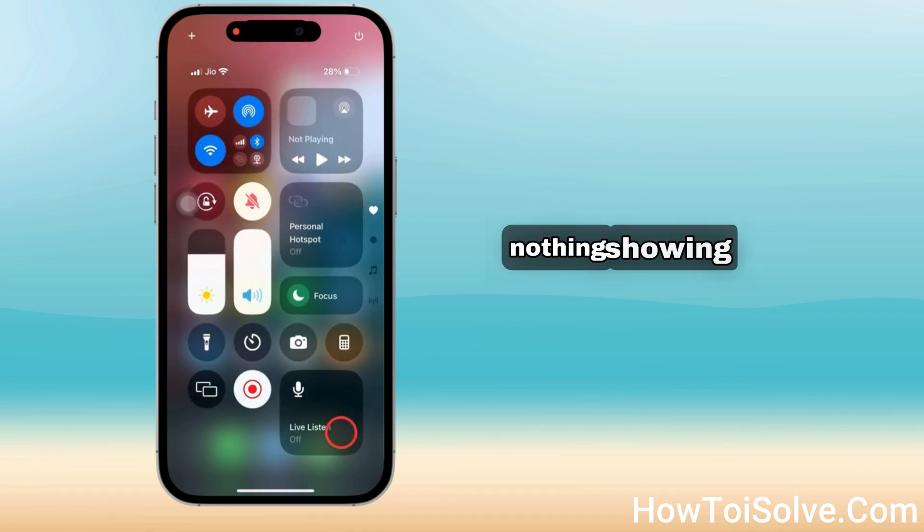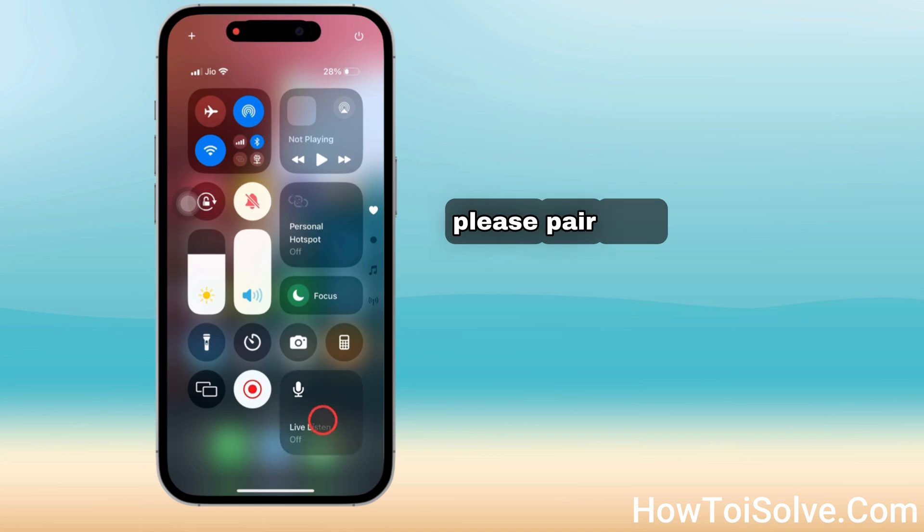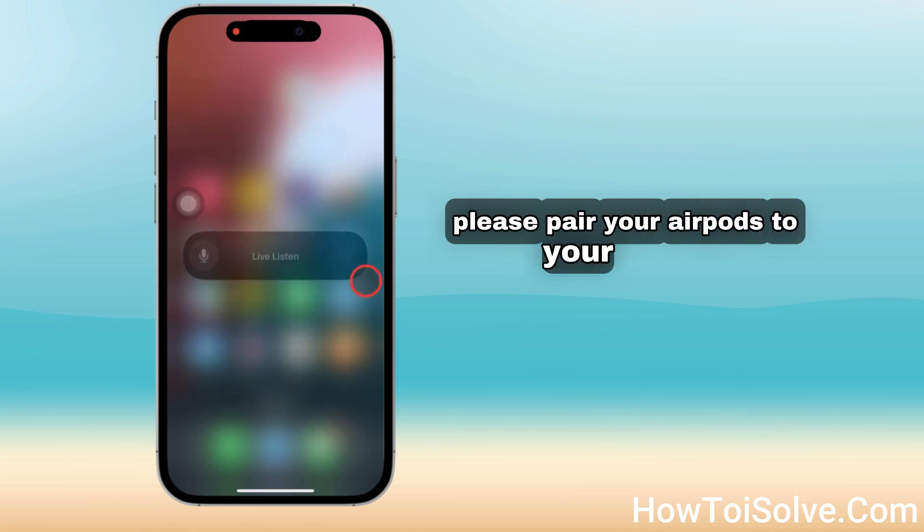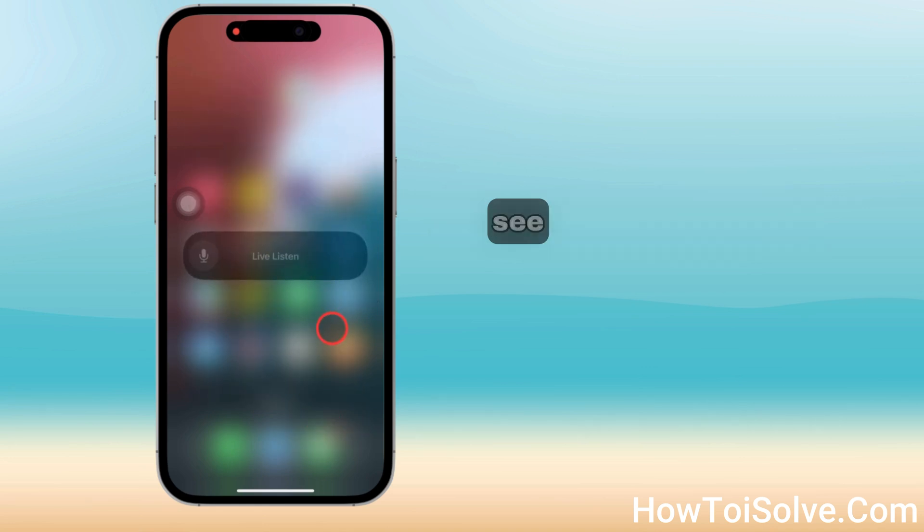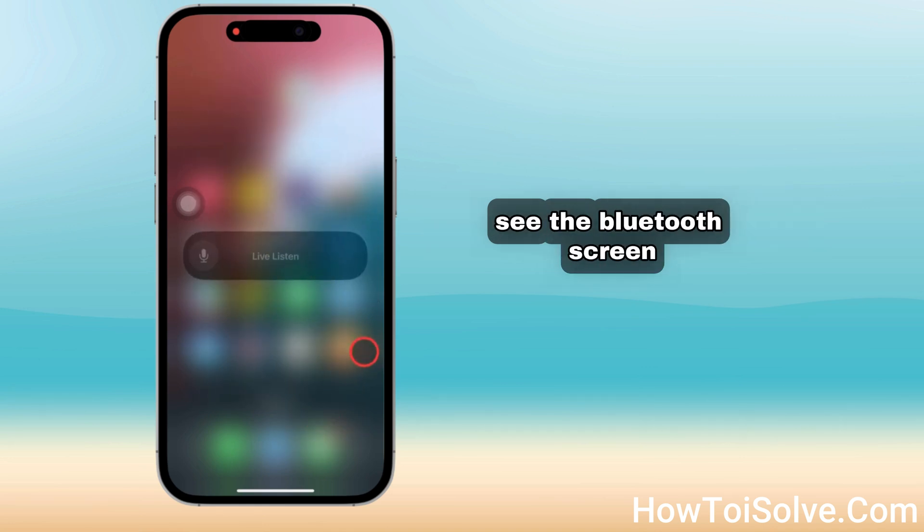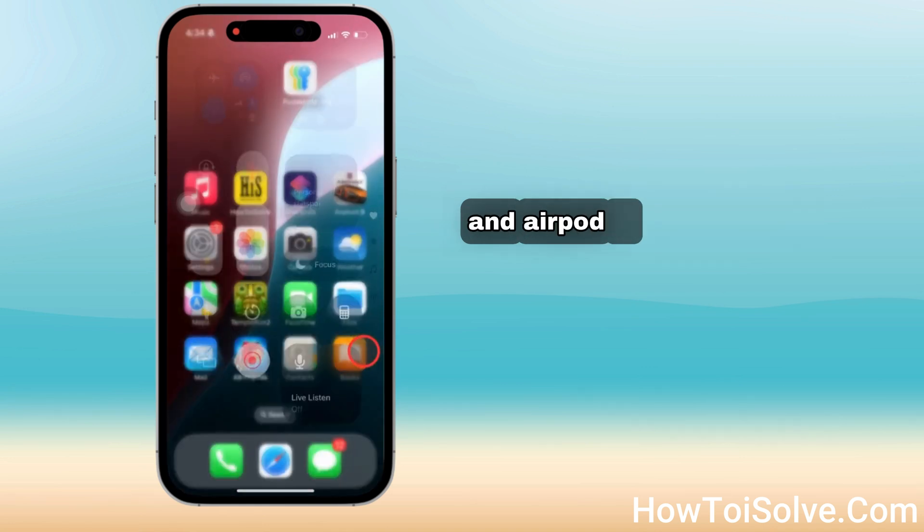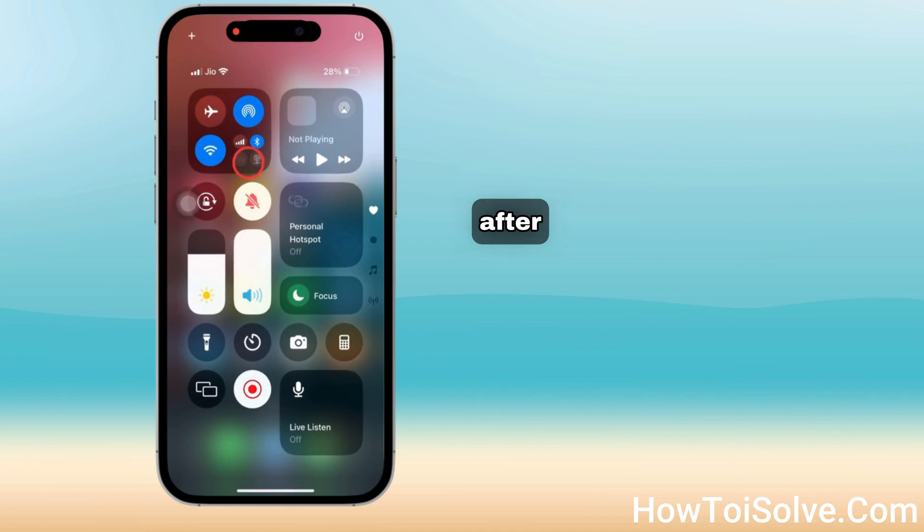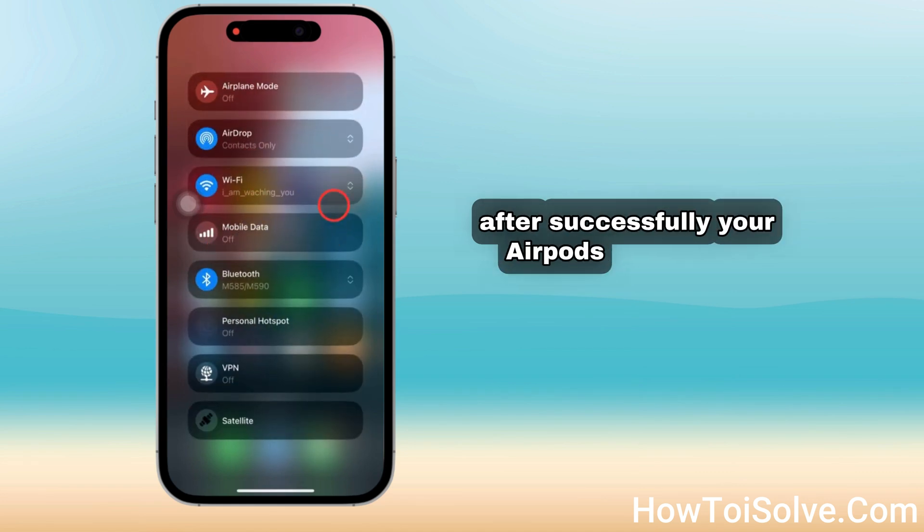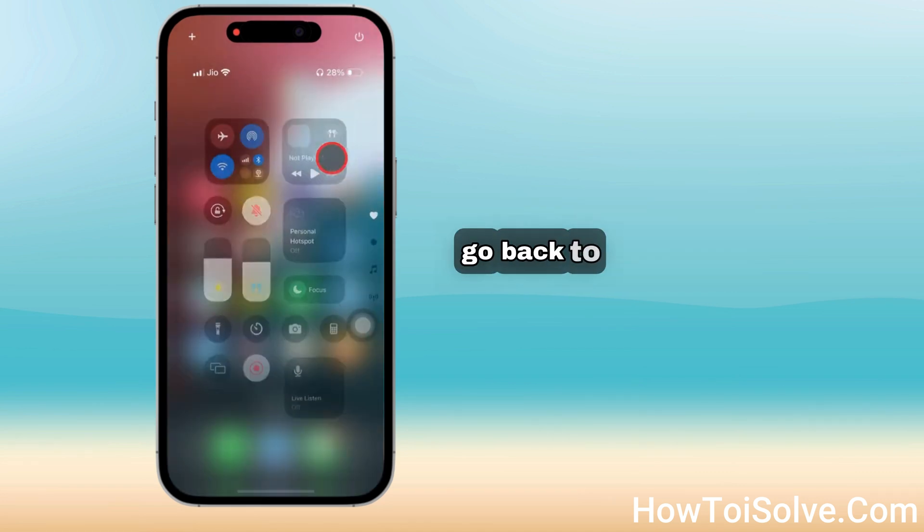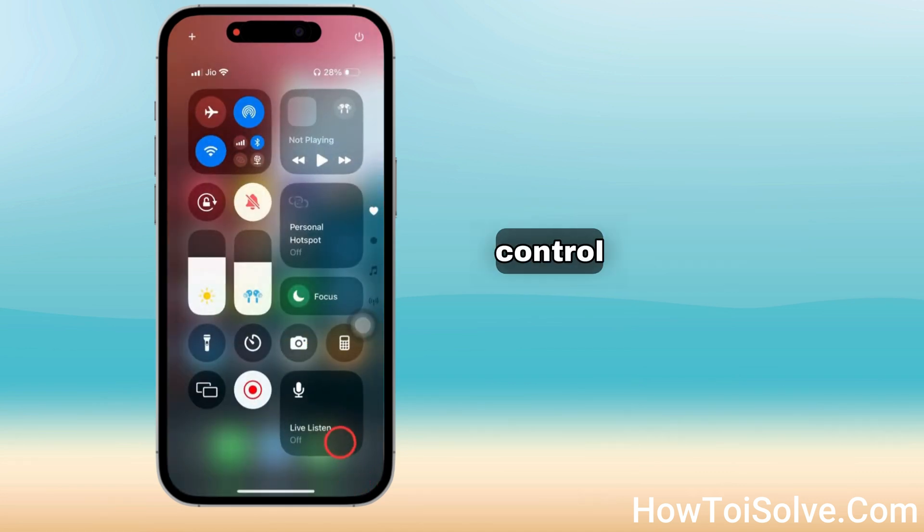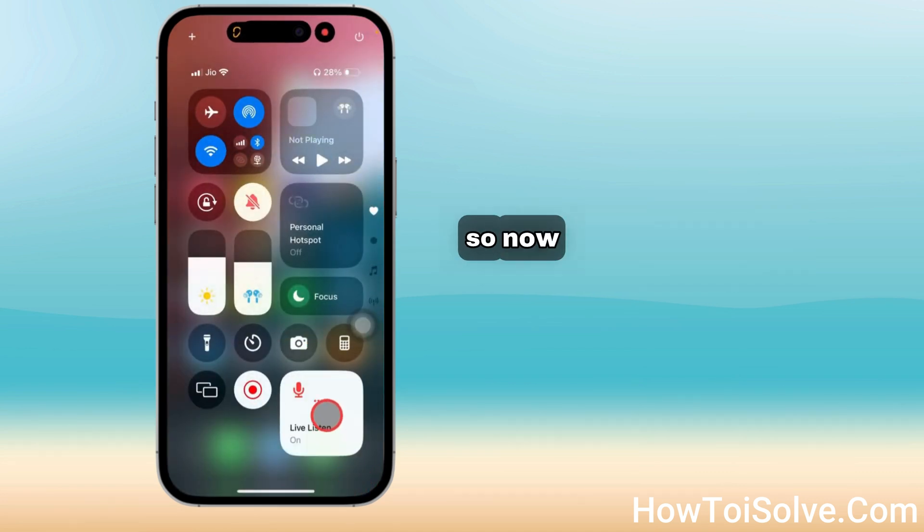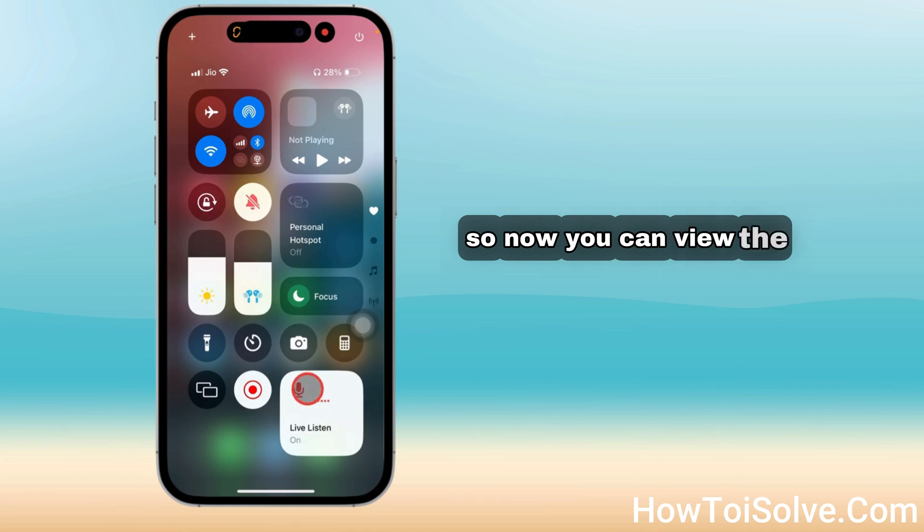If nothing is showing, please pair your AirPods to your iPhone. Check the Bluetooth screen to see if AirPods are connected or not. After successfully connecting AirPods, go back to the Live Listen control to turn it on.